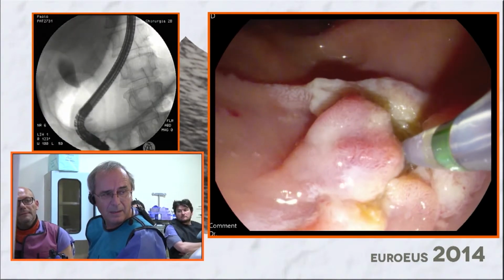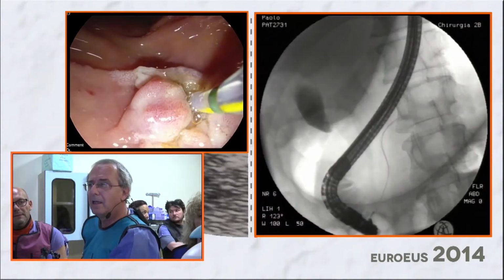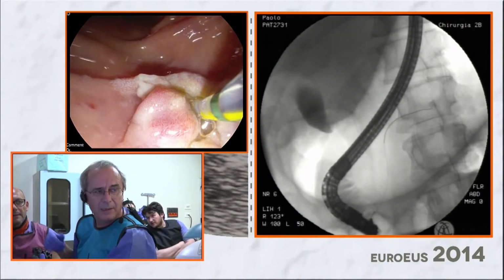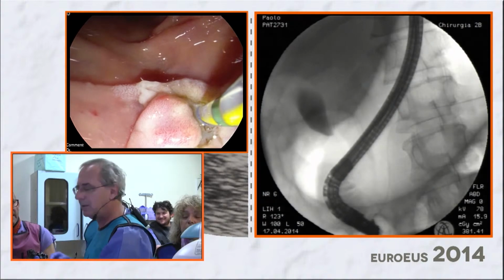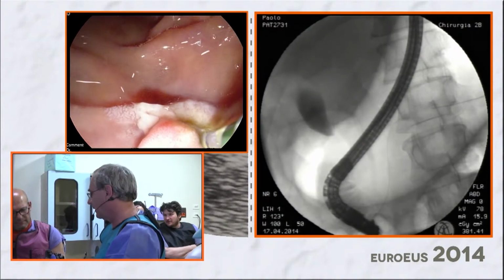Yes? Dai. Piano perché questo è il pancreas. This is the pancreas, as I told you. So, no, go into the tail. No. Vado. Tail. Perfetto. You stay there. Adesso we leave the guide wire in. Lasciamo la guida.